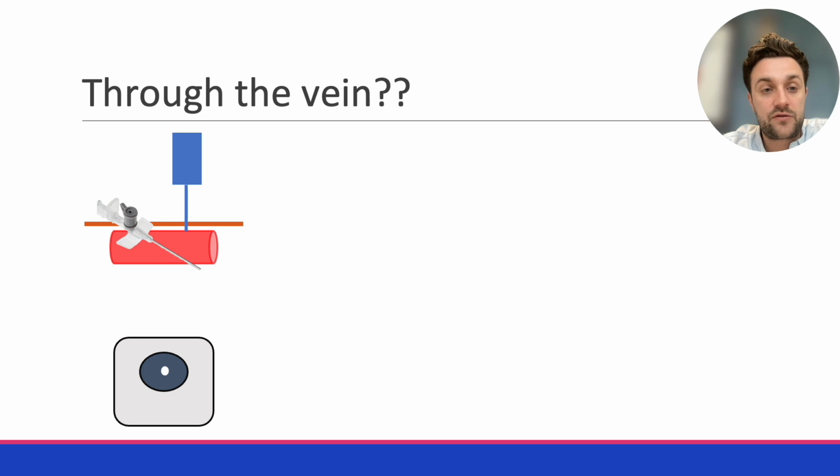So what if you do go through the vein? Okay, you can still save the day. Okay, so come back with the ultrasound probe until you get our bullseye sign.